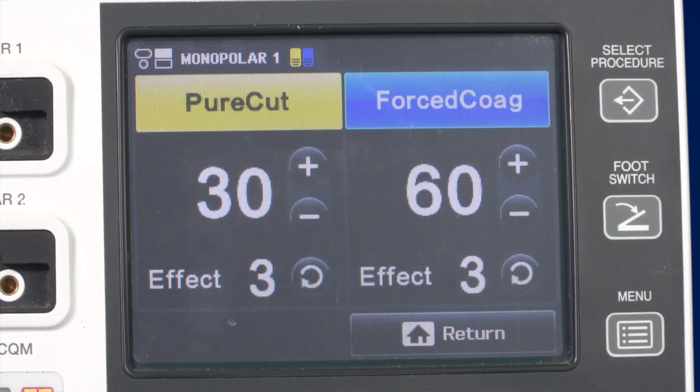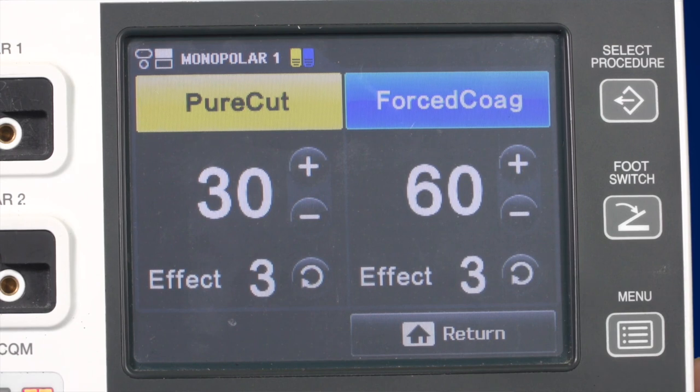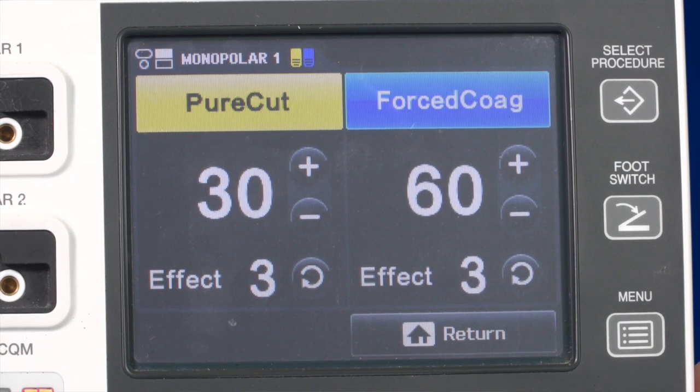Most generators on the market only allow you to change the power level. The ESG400 also has an additional feature called Effect. You can choose Effect 1, 2, or 3. By changing the effect, the user can make quick adjustments to the energy output. The higher the effect level, the more tissue effect you will achieve. As a rule of thumb, use a low effect for fine instruments and a high effect for larger instruments.